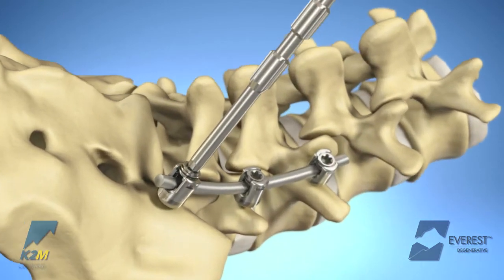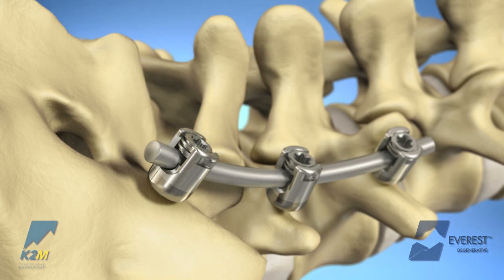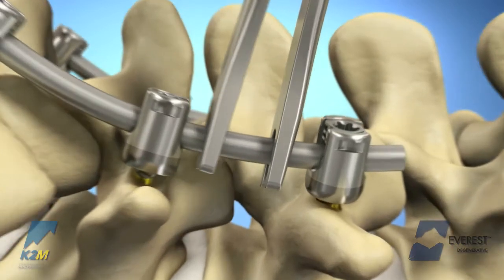If no reduction is necessary, the set screw can be inserted using either the long or short provisional driver. Due to its design, the Everest set screw facilitates easy introduction and reduces the potential for cross-threading.